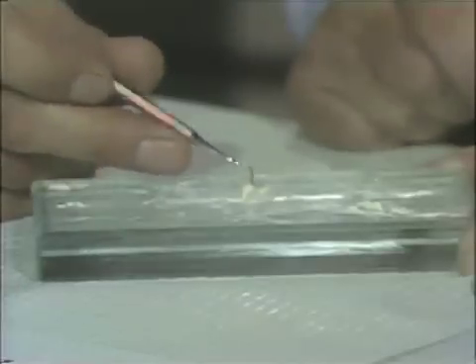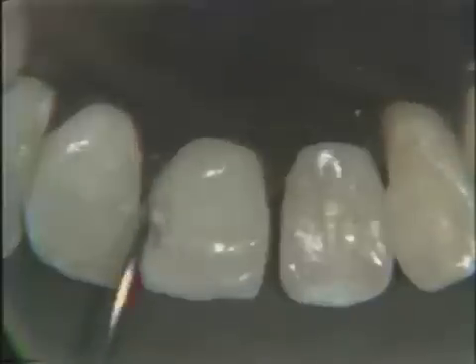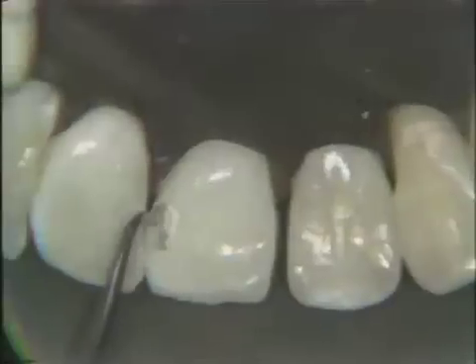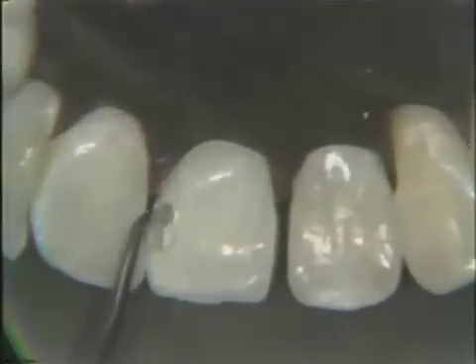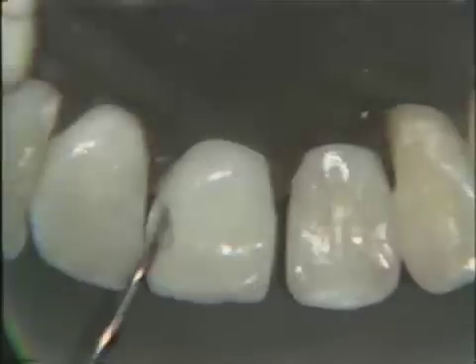Now, with the back of the same spoon that you used for the Cavitec, you can place a small amount, and it will cover this wall, contouring it to the area that was remaining from removing of the carious lesion. Notice the small amount. This is of extreme importance. Put it in and gently tap it and burnish it to place. And if you've mixed it correctly, this is all the time that it takes to place.